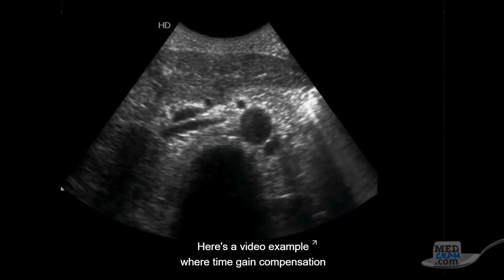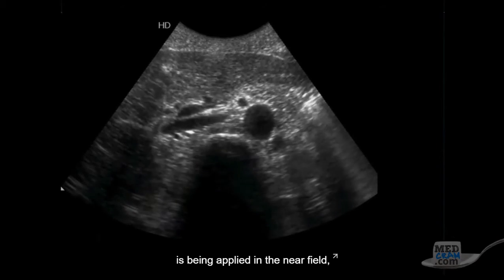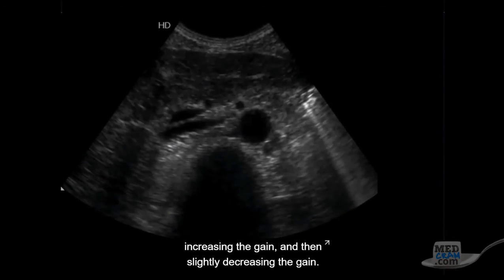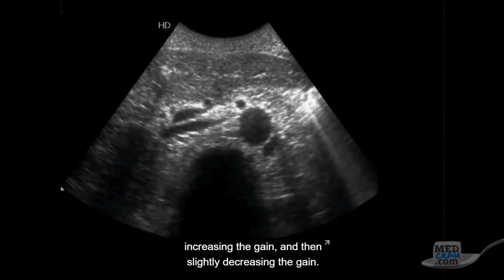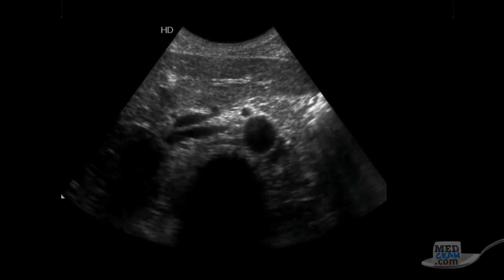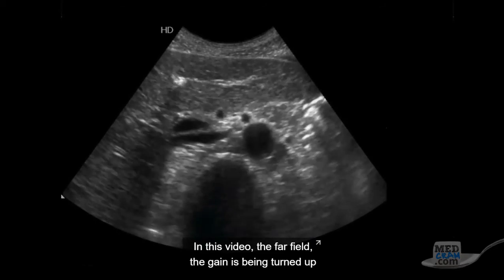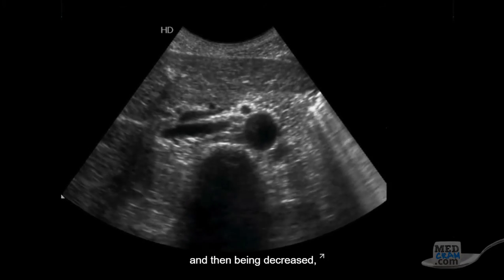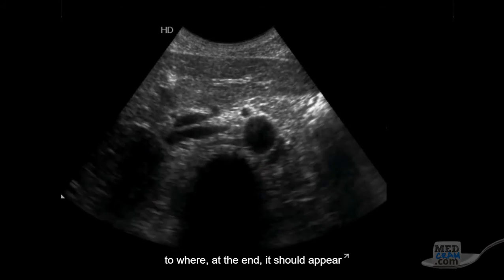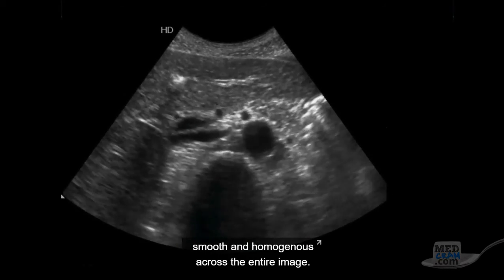Here's a video example where time gain compensation is being applied in the near field, increasing the gain, and then slightly decreasing the gain. In this video, the far field gain is being turned up and then being decreased, to where at the end it should appear smooth and homogeneous across the entire image.